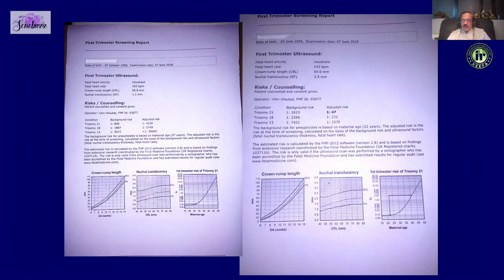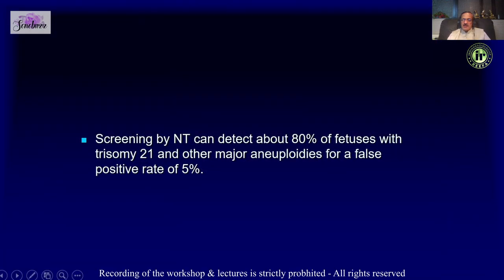After you have done the measurement, we need to correlate it with the CRL. We can do this using certain online applications or by going to the FMF site. NT can pick up almost 80% of fetuses with trisomy 21 and other chromosomal abnormalities.